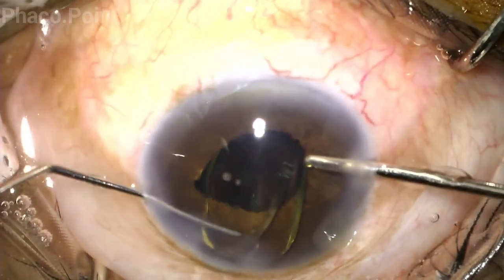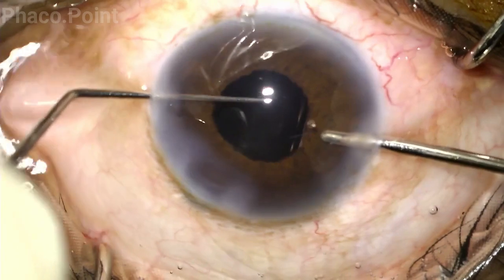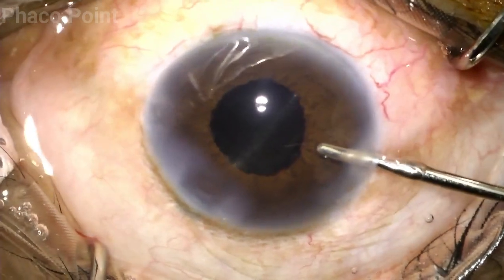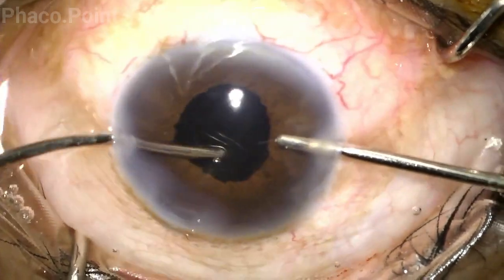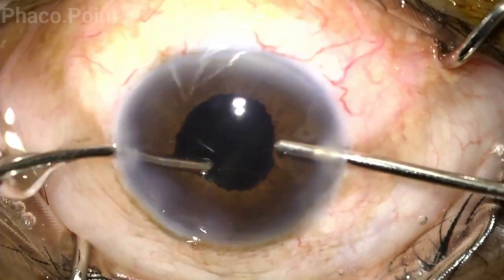The only challenge with inserting the foldable IOL is that because of the limited visibility you may need to confirm that the entire IOL is truly within the capsular bag. Since this was a hydro implantation of the IOL, there is hardly any necessity for a viscoelastic wash.